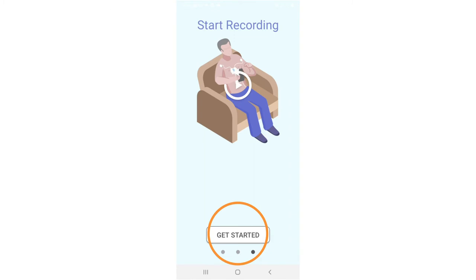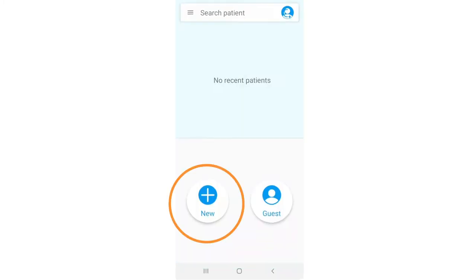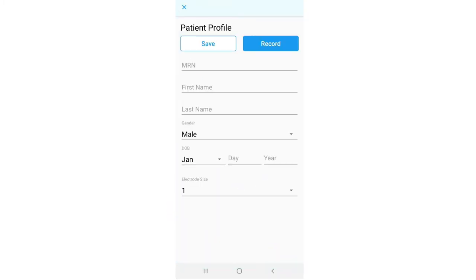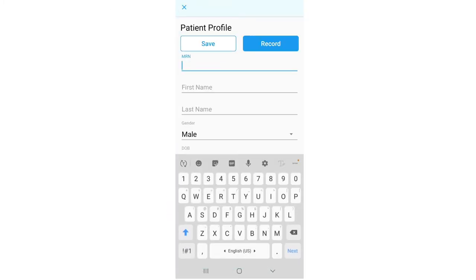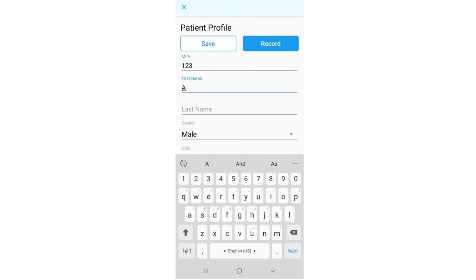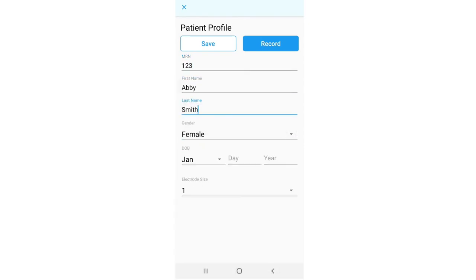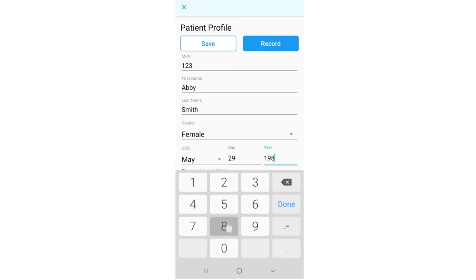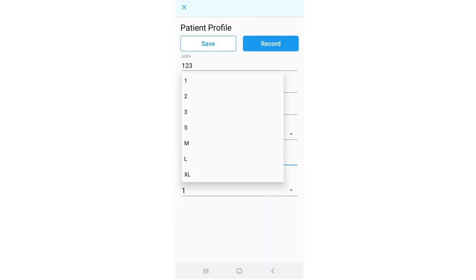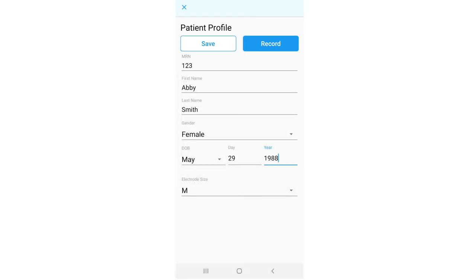Press to get started. Tap on the new button to input the patient's medical record number, MRN or any arbitrary numbers if unknown, first and last name, gender, date of birth, and electrode strip size.